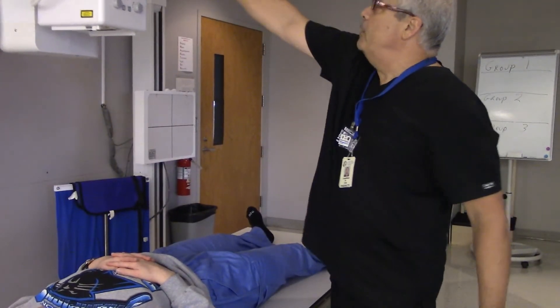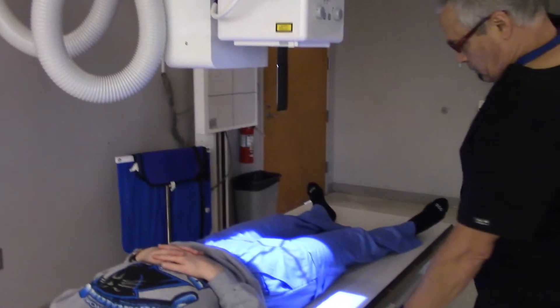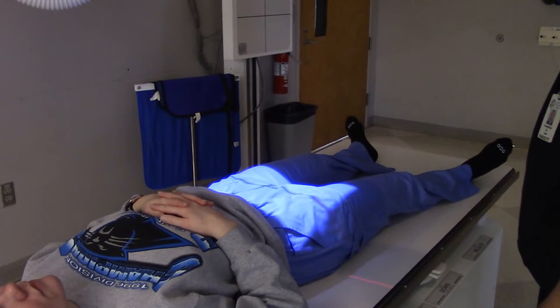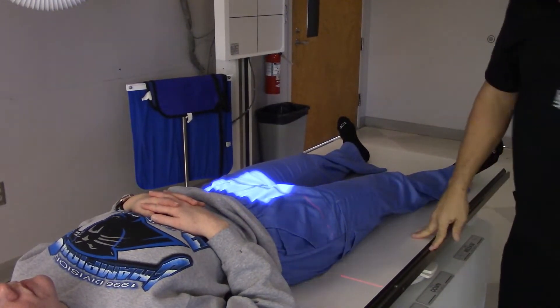Bring on the tube. Put this thing in detent — right there it goes. And I am going to go ahead and cone down some because I know I don't need that much field coverage.